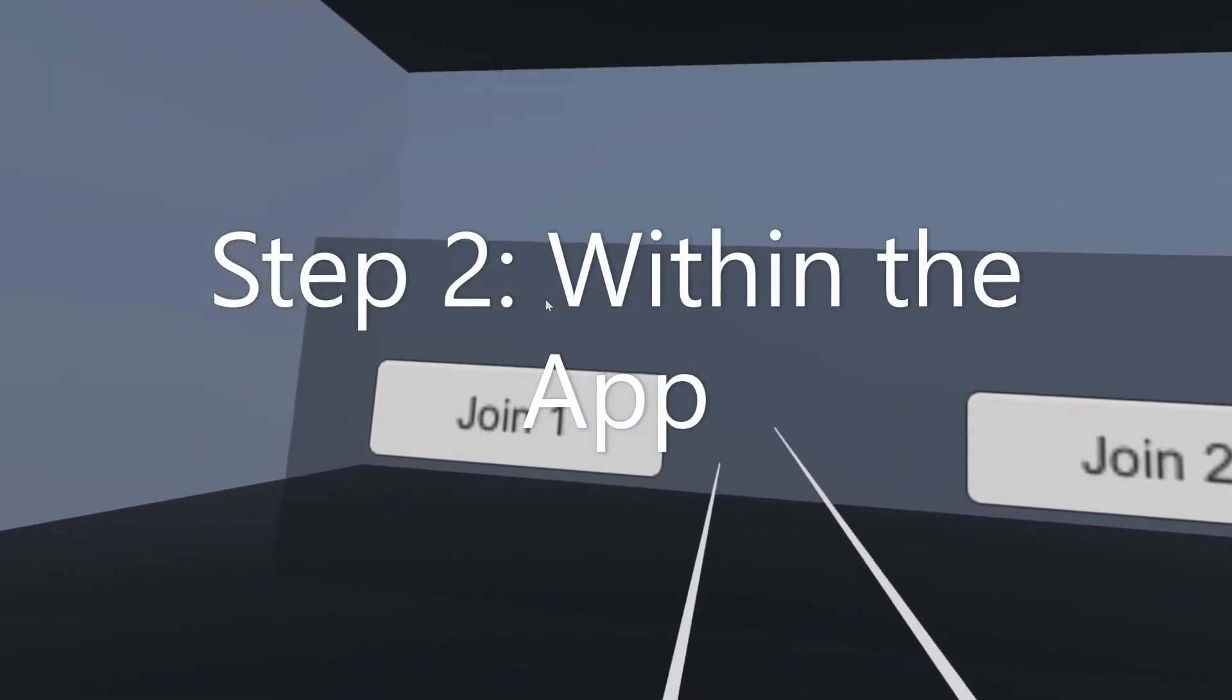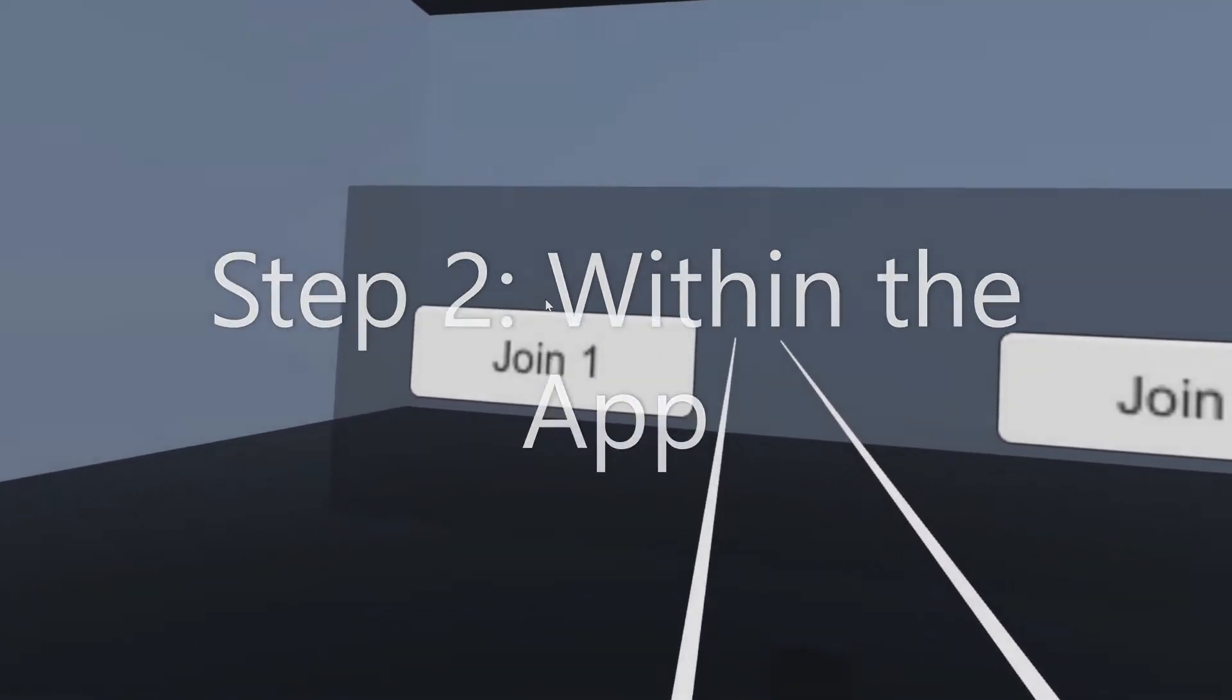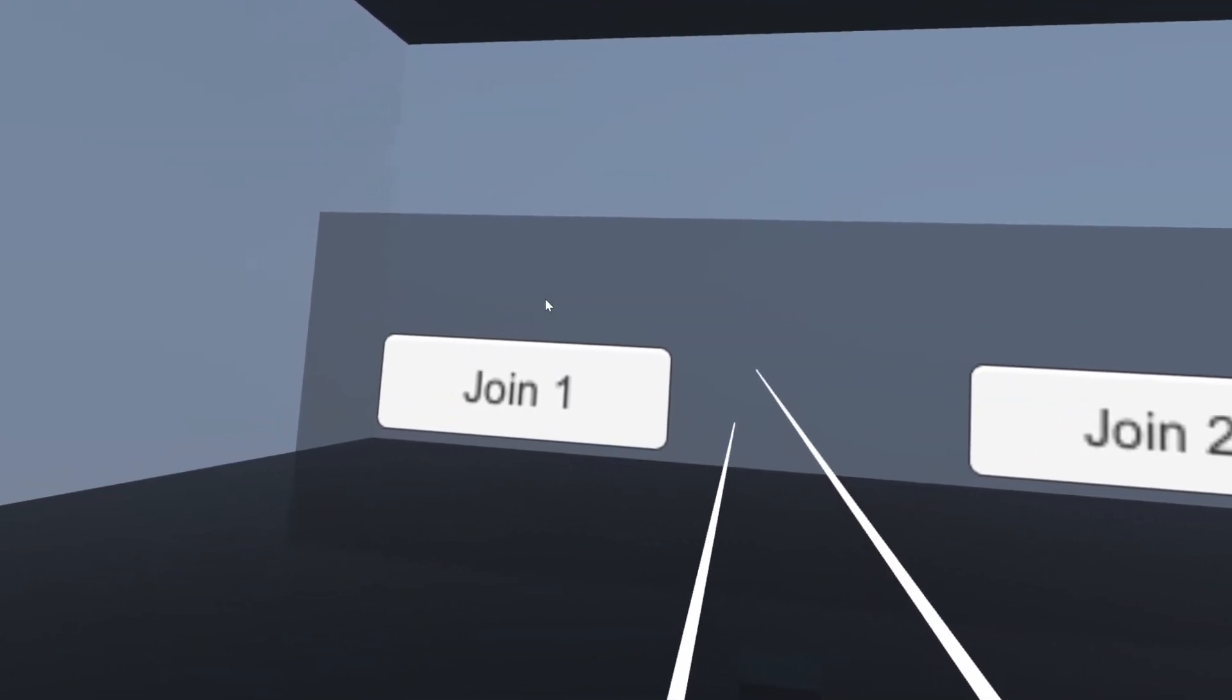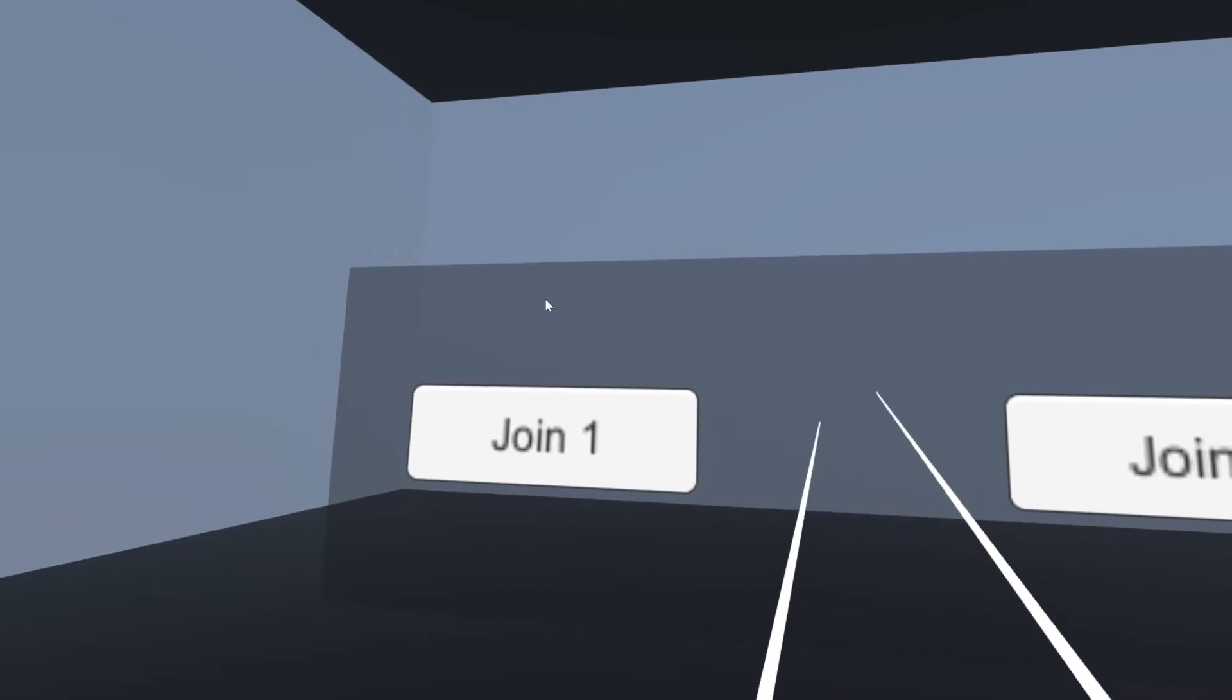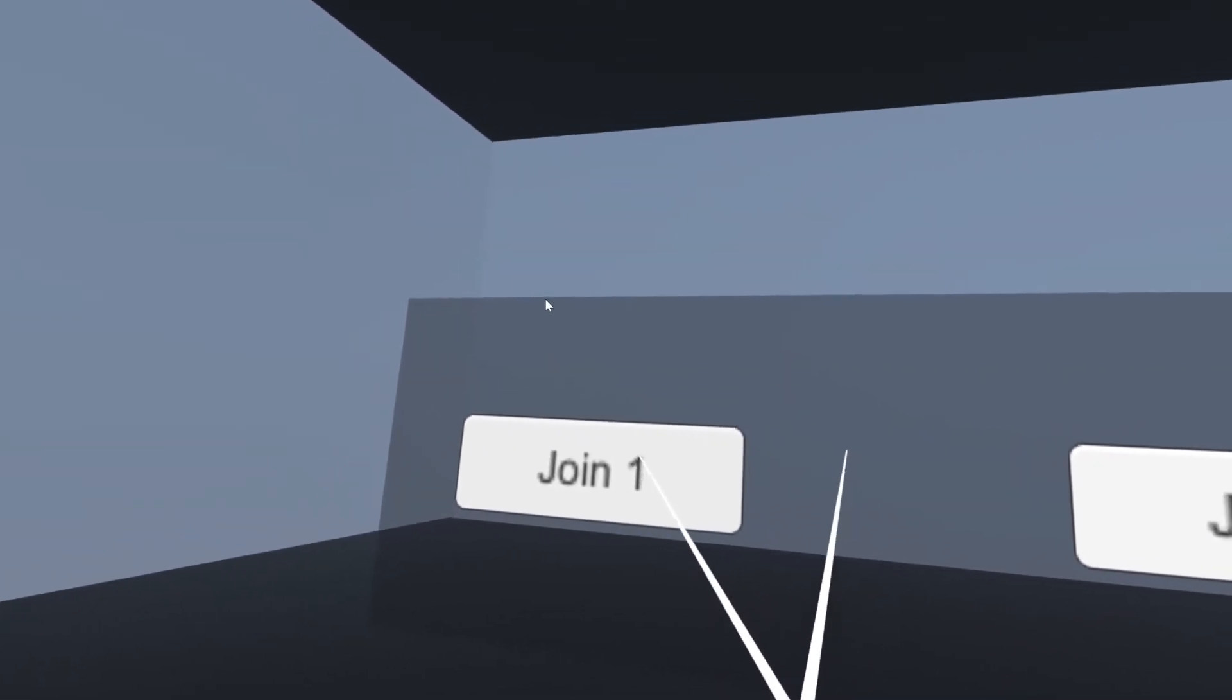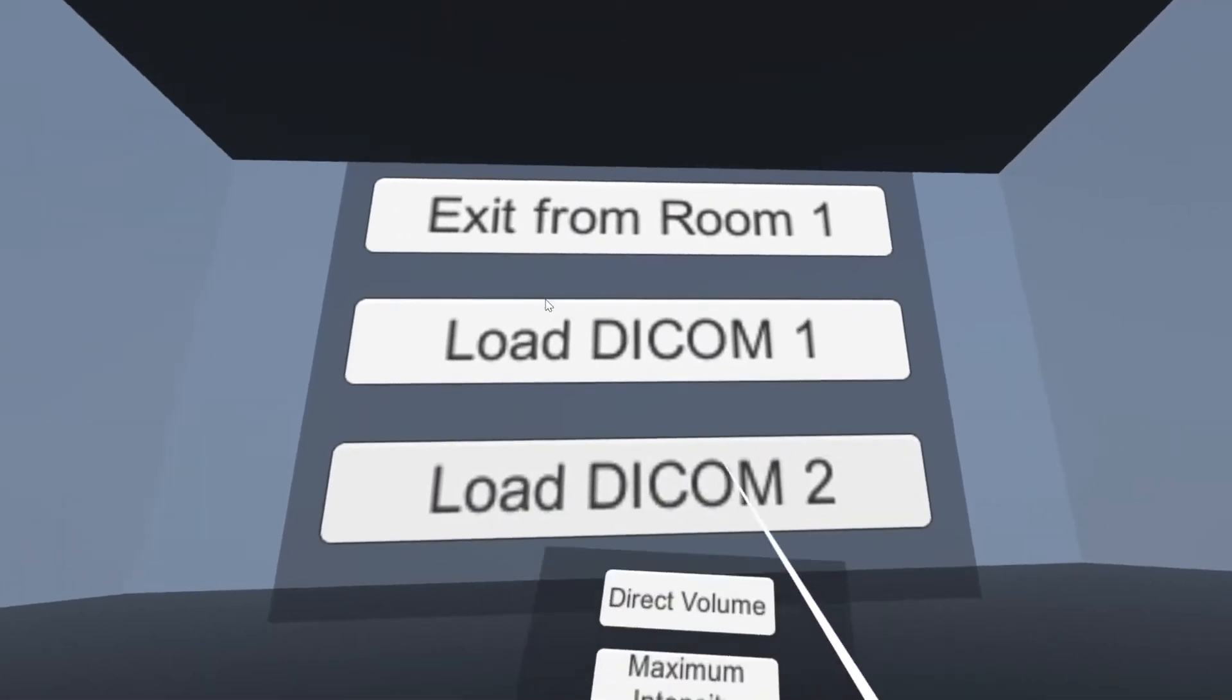Users, both doctors and patients, are first introduced into a lobby room. Here they can join either room 1 or room 2. We'll join room 1 here.